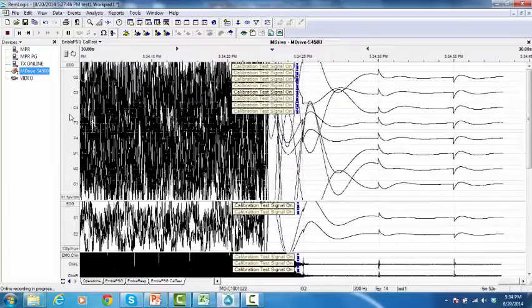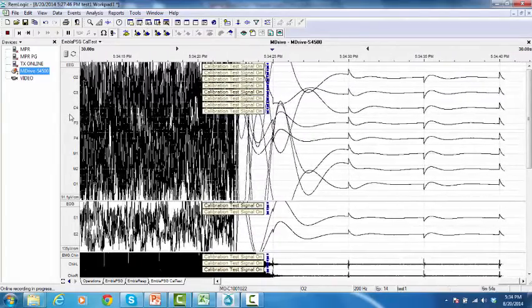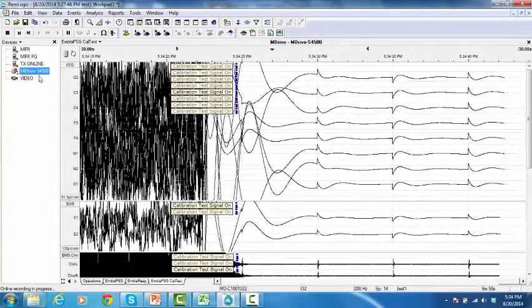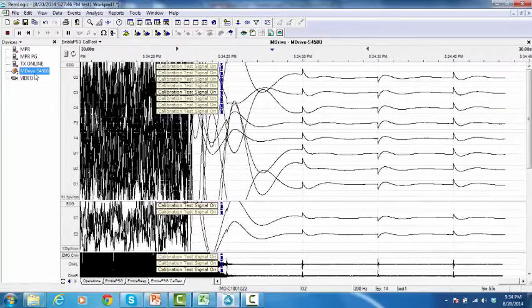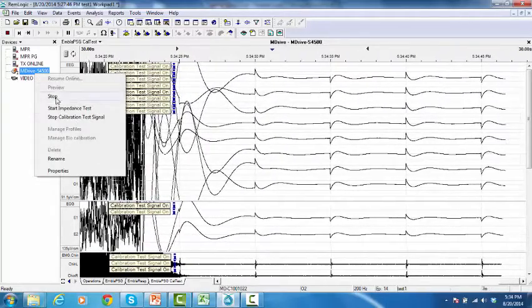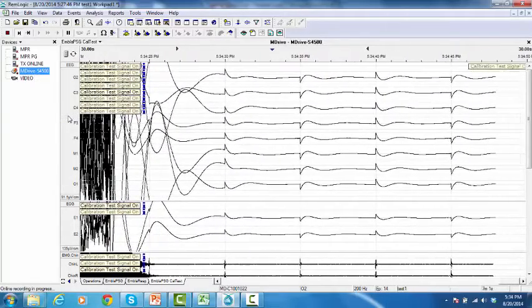To stop the calibration signal, from the device manager, right-click on the M-Drive and select Stop Calibration Test Signal.